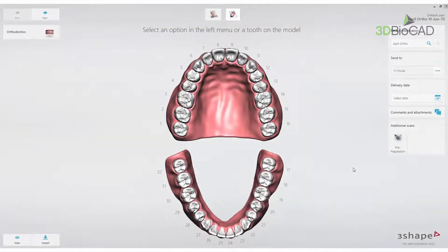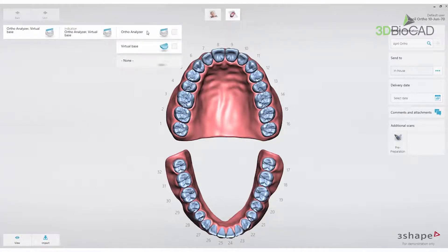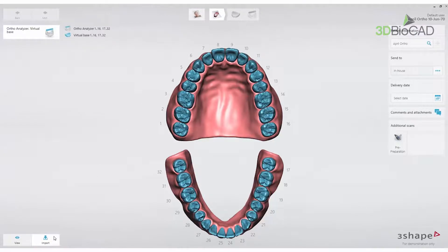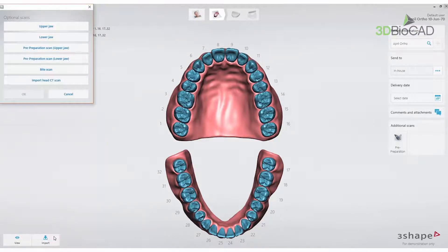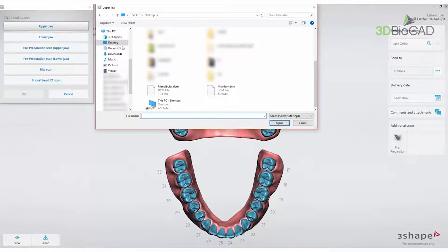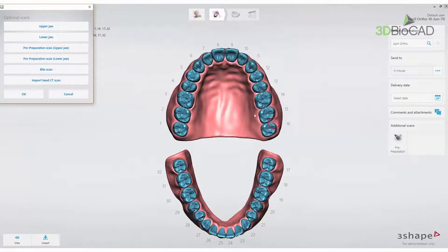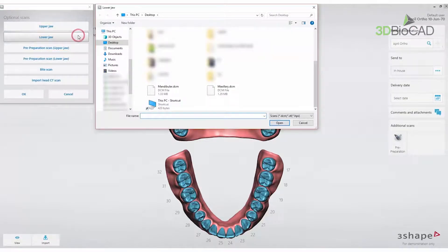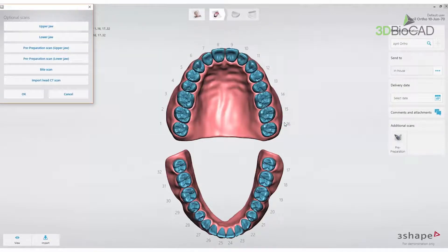When a new patient with a new case has been created, open the Dental Desktop order form by selecting the first icon, Case Setup, in the workflow bar. Select Orthodontics and click on Virtual Base and/or OrthoAnalyser according to what you need to do with the case. Select the Import button in the lower left corner of the screen and import Upper Jaw, Lower Jaw, and CBCT Scan subsequently.